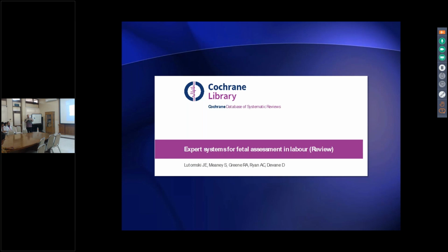If I give the same tracing to you all here and ask you to write out your interpretation, I bet we will get some differences in interpretation. Frighteningly, we also know that if you give the same CTG to the same person at two different time periods, they'll disagree with themselves sometimes. Because the CTG interpretation is rather subjective, isn't it?